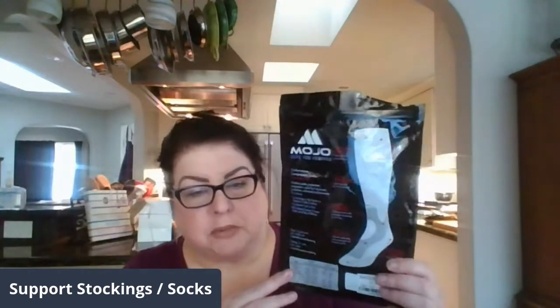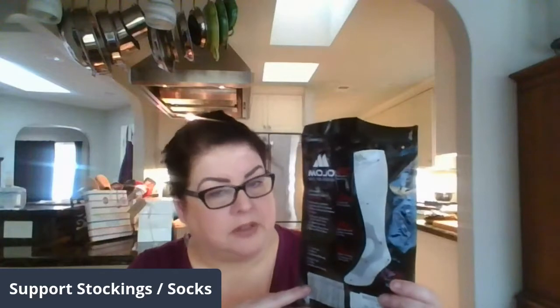I measured my calves earlier before I did this video and they're 22 inches around at the largest part. I've been buying the 5X because they're super comfortable, but what I'm realizing at the end of the day is that I'm having to pull them back up, so I believe I should be buying the 4X from Mojo. These have what they call 20-30 mmHg — I have no idea what that means, I'm gonna guess it has to do with the material.